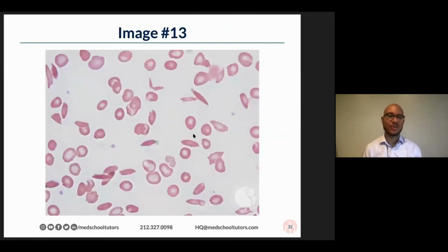Just a few more. You all are prescient, because a lot of what folks have been putting in the chat for other peripheral smears is true for this one. So if I said someone from the Mediterranean, someone of African ancestry who frequently needs to come into the ED, unfortunately, dehydrated, in pain, we're thinking here, of course, of sickle cell anemia.